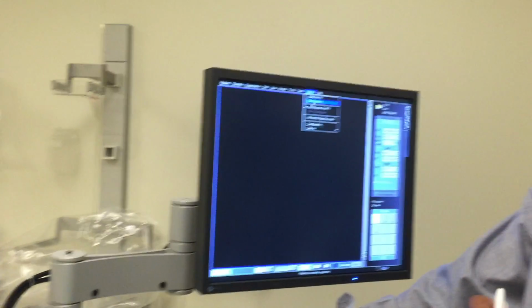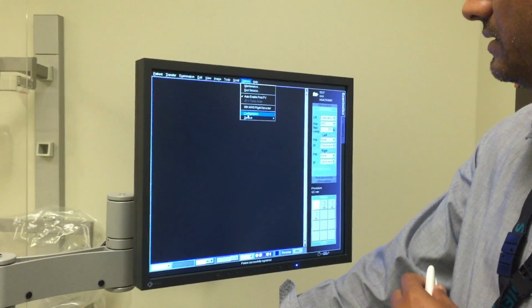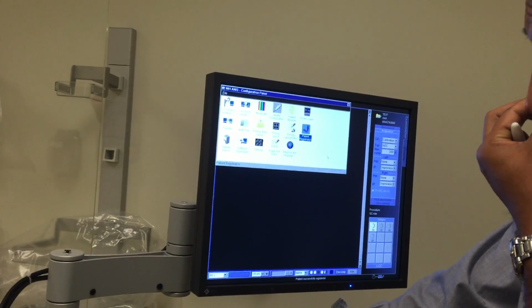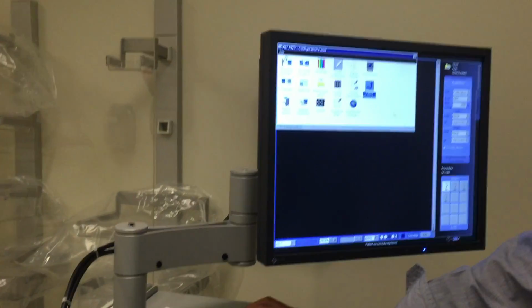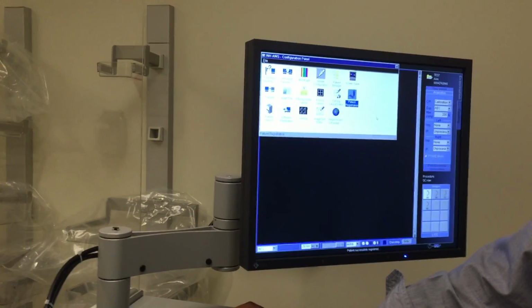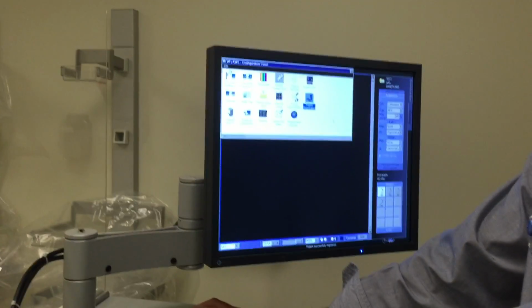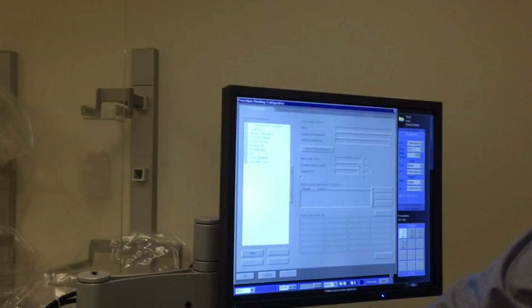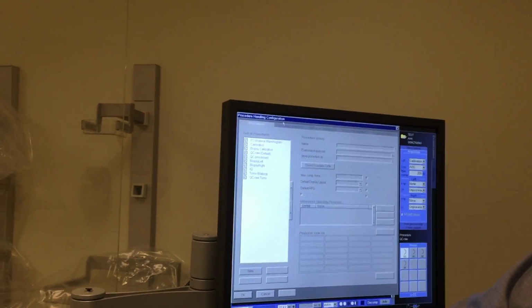So there are different options. We can go to configure, and here we do different settings. Oh, biopsy. Oh, this is cool. So you can choose the needle and the procedure handling, what type of procedure.